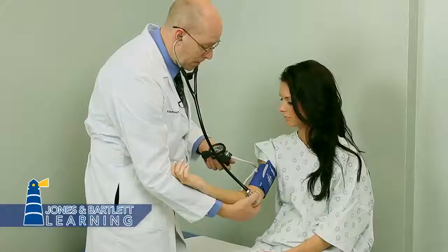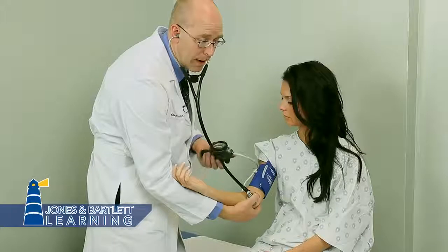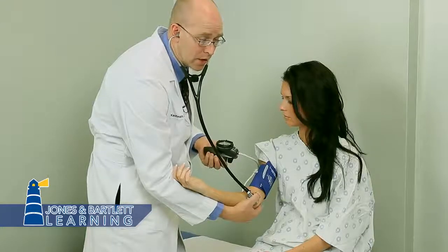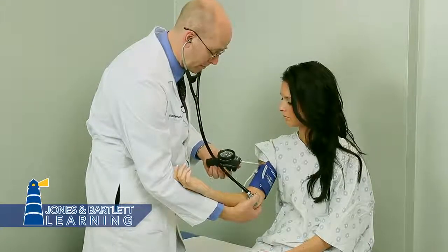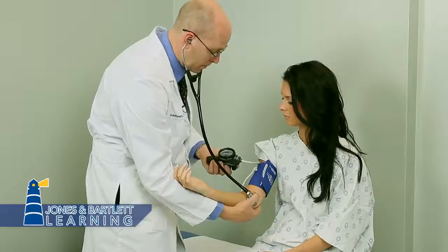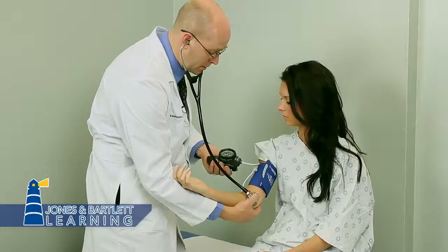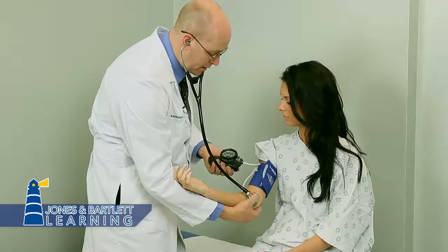And now I'm going to repump up the blood pressure cuff to 20 millimeters above what it disappeared at with my palpatory technique. So it disappeared at 110. Now I'm going to go to 130. So I'm there, and then I just very gently open up the valve, see when the first pulse comes in. And I'm dropping about 2 or 3 millimeters per second. Pulse came in at about 108.